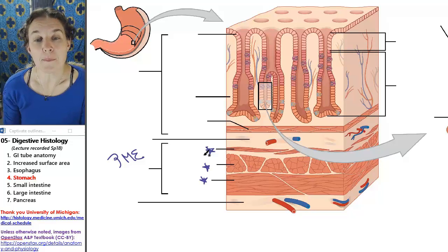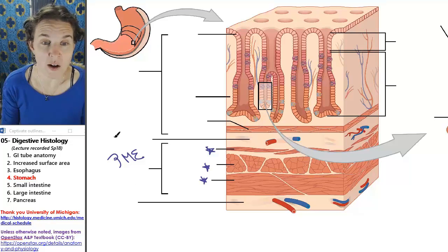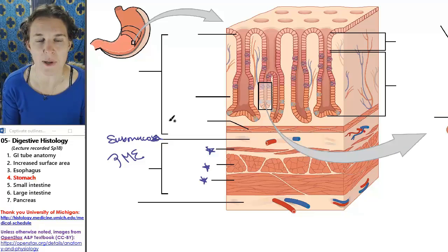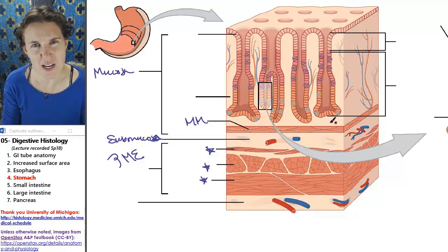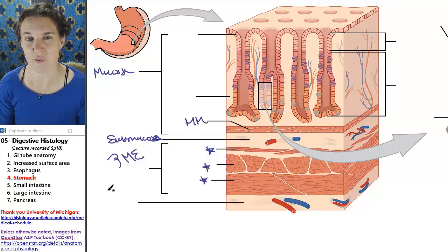So, luminal to muscularis externa, we've got our submucosa, and there's usually not much significant in the submucosa, but usually muscularis mucosae is also well-defined in the stomach. So this is all part of the mucosa. Muscularis mucosae is usually easier to find in the stomach than other places. So that's another thing that I kind of sort of focus in on.